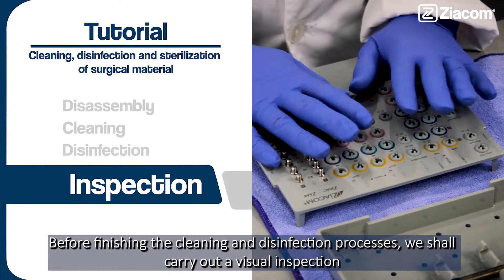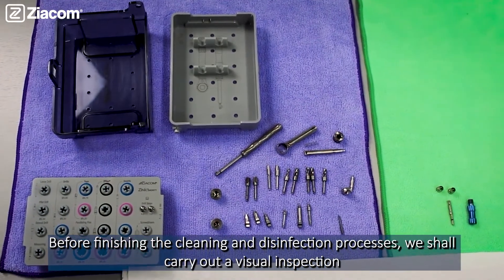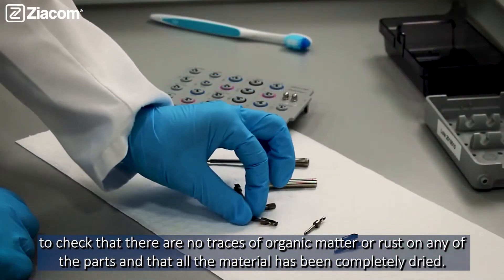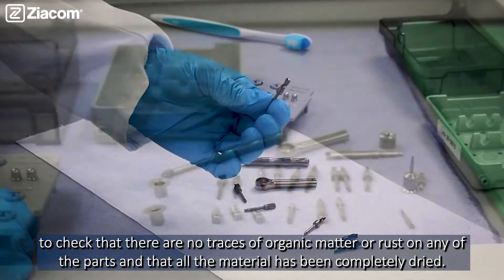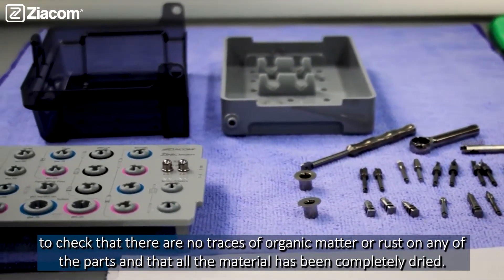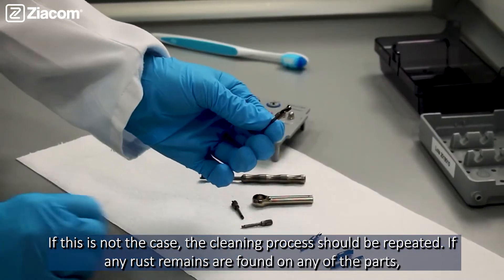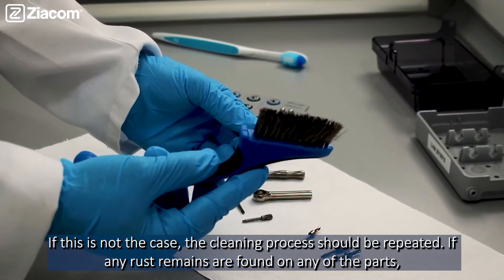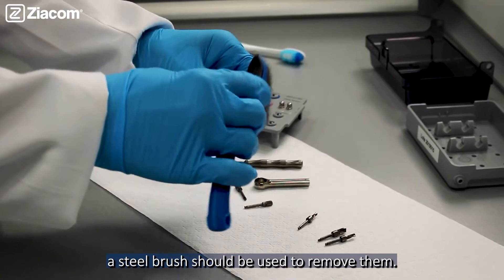Before finishing the cleaning and disinfection processes, we carry out a visual inspection to check that there are no traces of organic matter or rust on any of the parts and that all the material has been completely dried. If this is not the case, the cleaning process should be repeated. If any rust remains are found on any of the parts, a steel brush should be used to remove them.